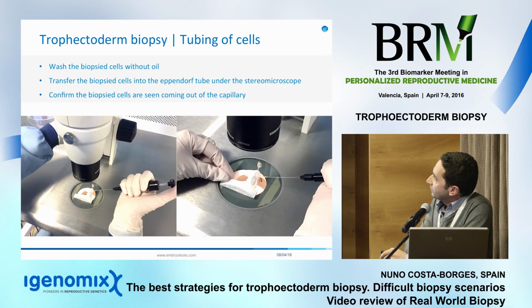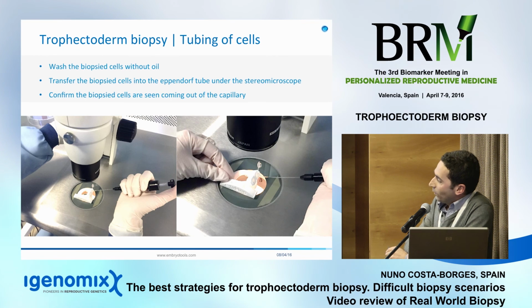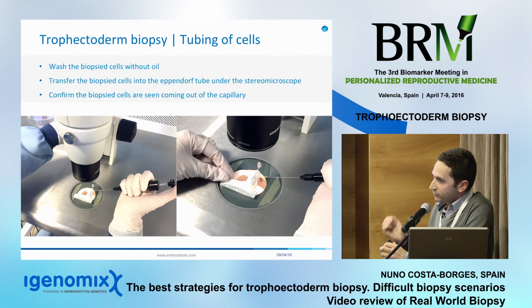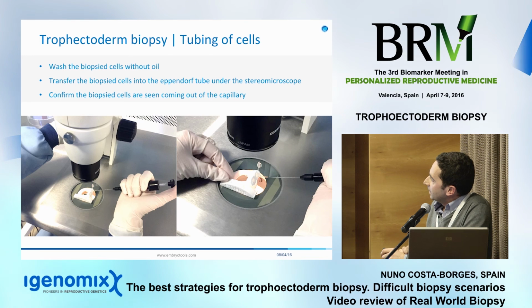And then we should transfer them into this Eppendorf tube that has been supplied by your molecular analysis company, under the stereo microscope. And in here, to confirm that the cells are really well transferred, we should see them coming out of the capillary. So we should transfer them very carefully, slowly, until we see the cells coming out of the capillary we use for the tubing.